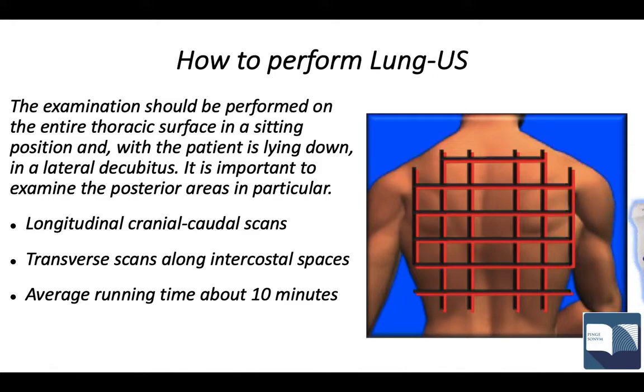The average running time of the exam is about 10 minutes, but it depends so much on the condition of the patient. The more the patient can change the decubitus spontaneously, the more the exam is easy and fast. It depends also on the skill of the operator.